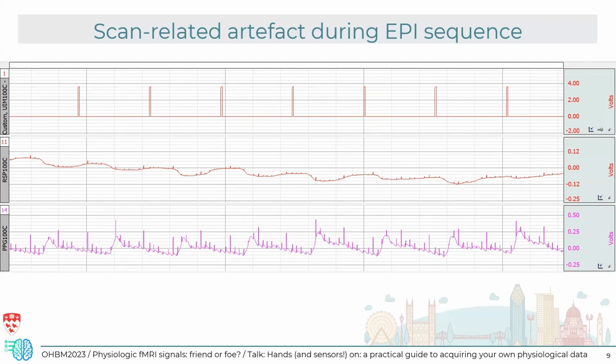And what we found was that we could get rid of this artifact just by making sure everything was very tightly grounded when attaching it to the patch panel, and to make sure that there were absolutely no loops, even in the cables on the control room side. So that's just an example of a scanner artifact. It's at about 15 Hertz, so it's not very obvious what was causing it. But the important thing is to eliminate that as much as possible, just from a hardware perspective.